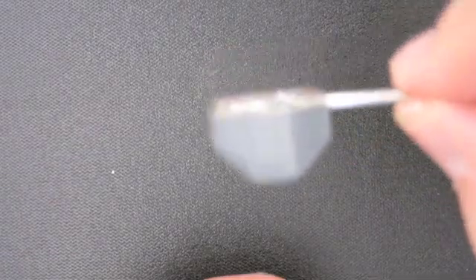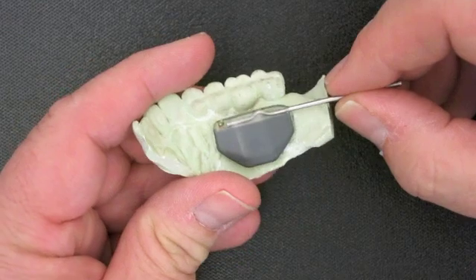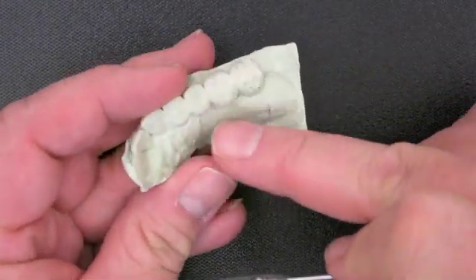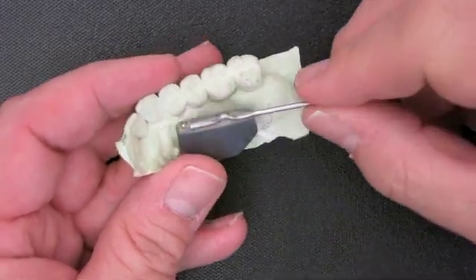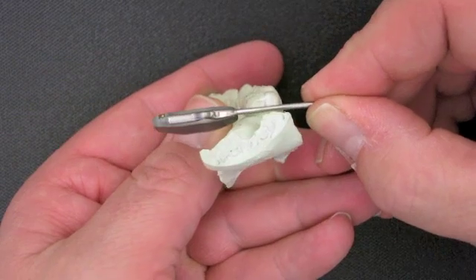Just a quick comment about this cast that you see here. We do quadrant impressions, but we do need to get all the way to the midline, and the reason for that is we want that battery to be comfortable, and we need all the palatal information we can get in order to make that happen.